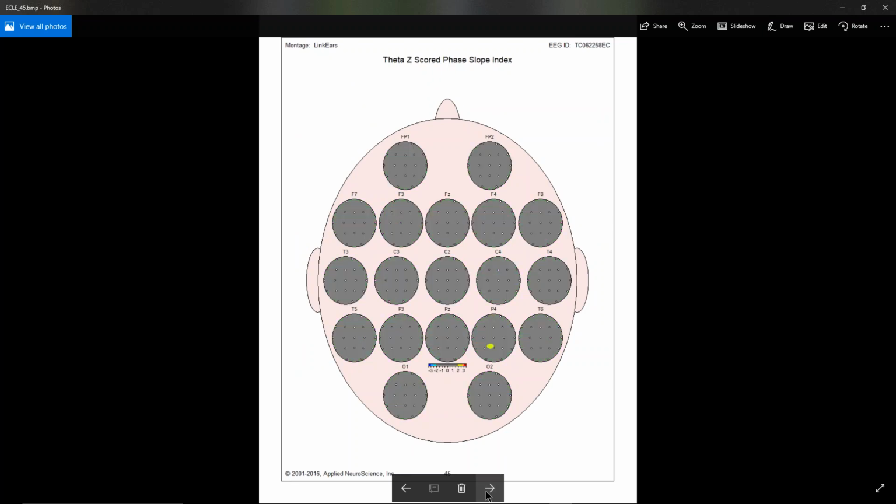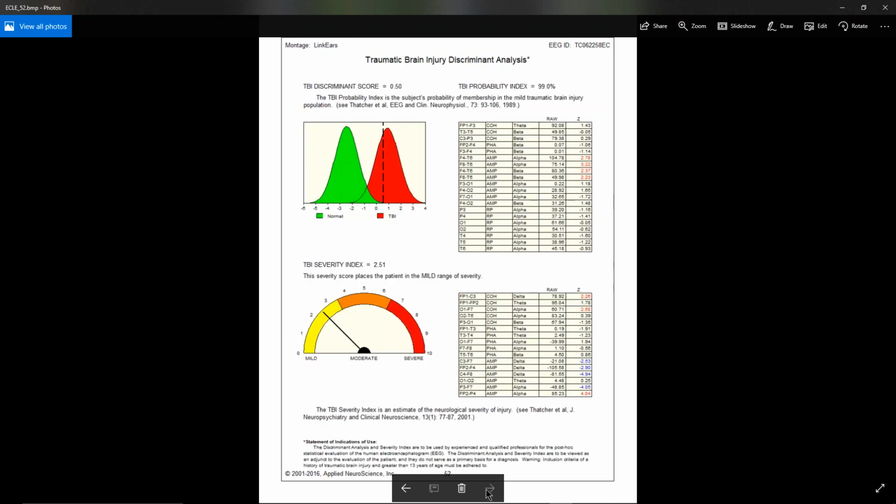This is directed communication. Here's the statistical values. Each of these heads represents one electrode location in its relationship with all the other electrode locations. So here we have FZ in relation to all, it's suggesting it's having a difficult time communicating with O1 and a little bit over here with O2, but mostly O1. And again, O1 is having problems communicating with FZ. So it's a mutual problem. That seems to be the only ones that are showing up that way.